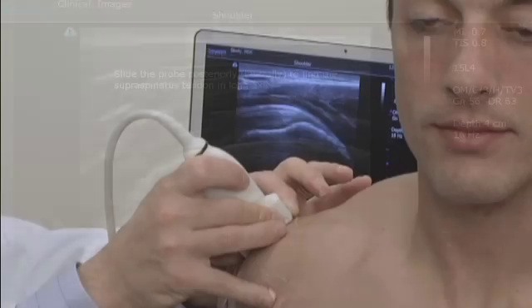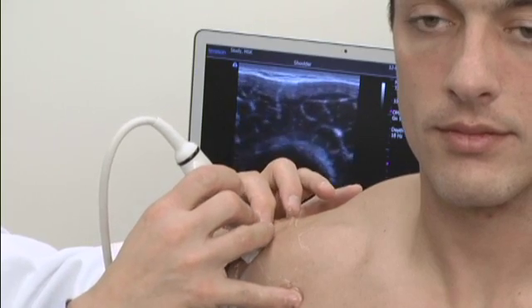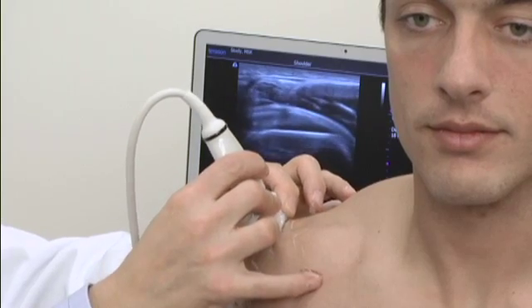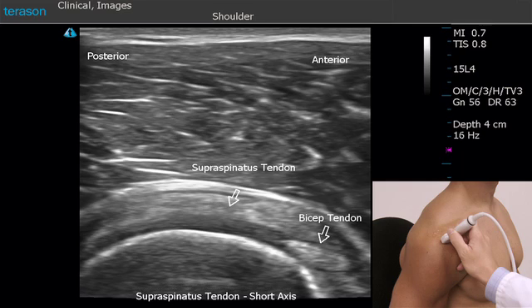What I'm going to do next is rotate the probe 90 degrees so that we see the tendon in short axis. In short axis, the tendon will appear as a tire on a wheel. The wheel represents the humeral head with the articular cartilage, and the tire is the supraspinatus tendon.